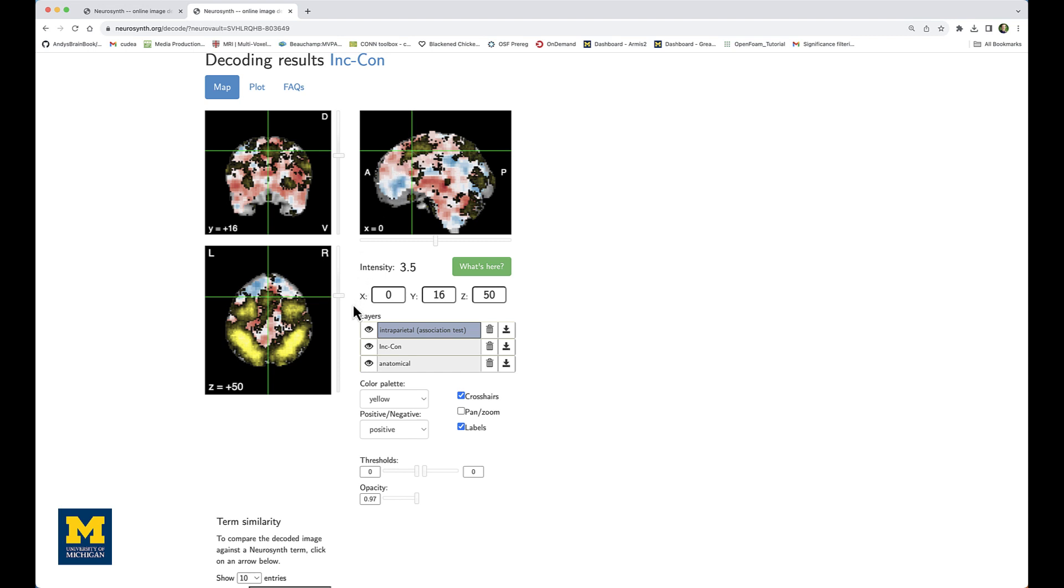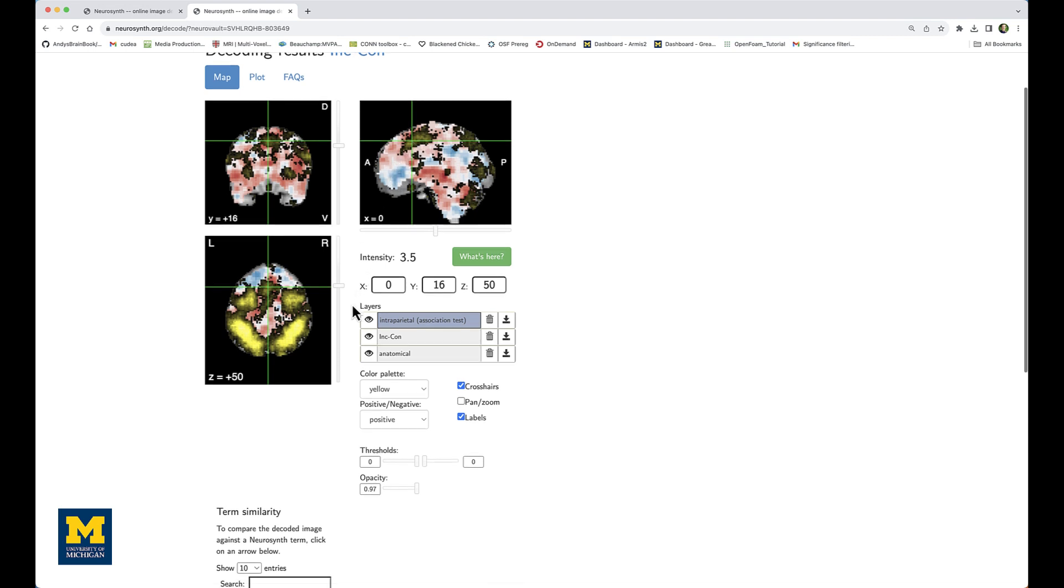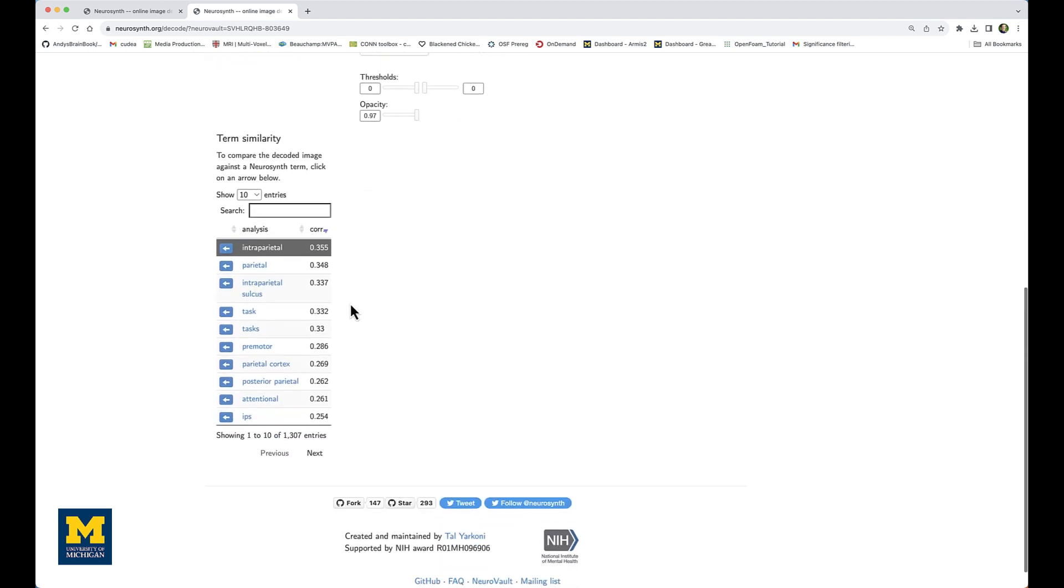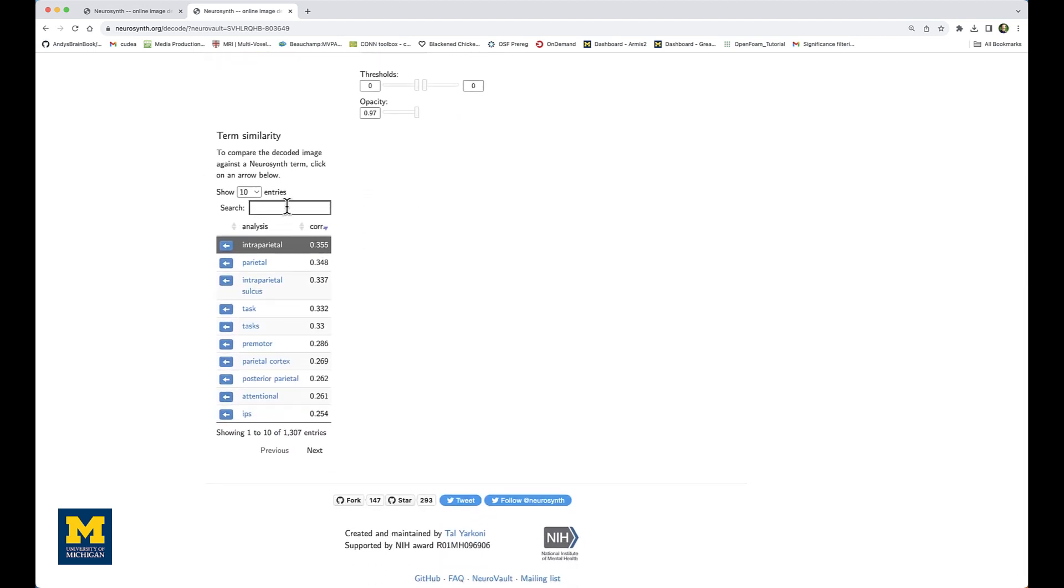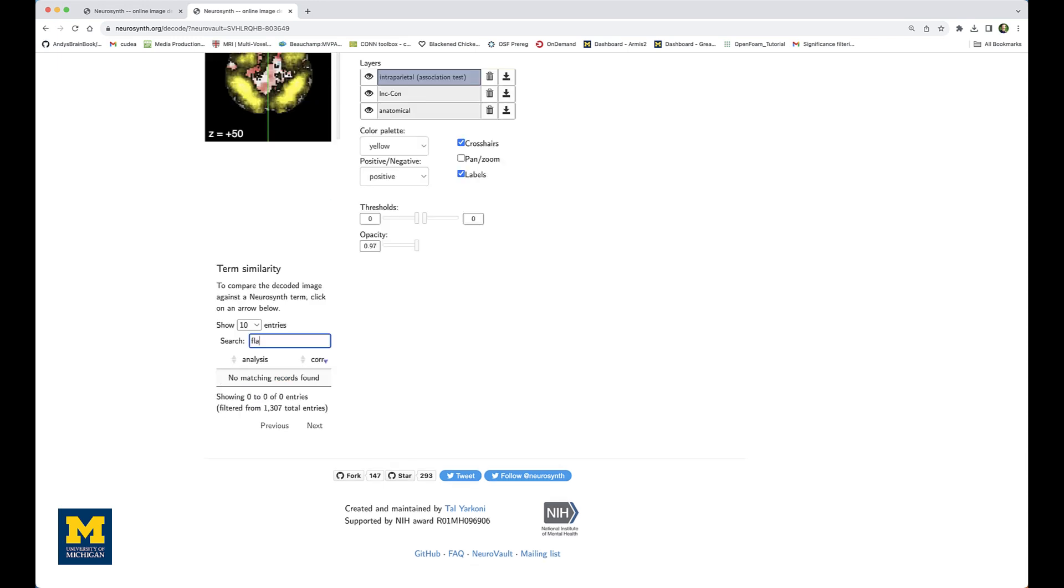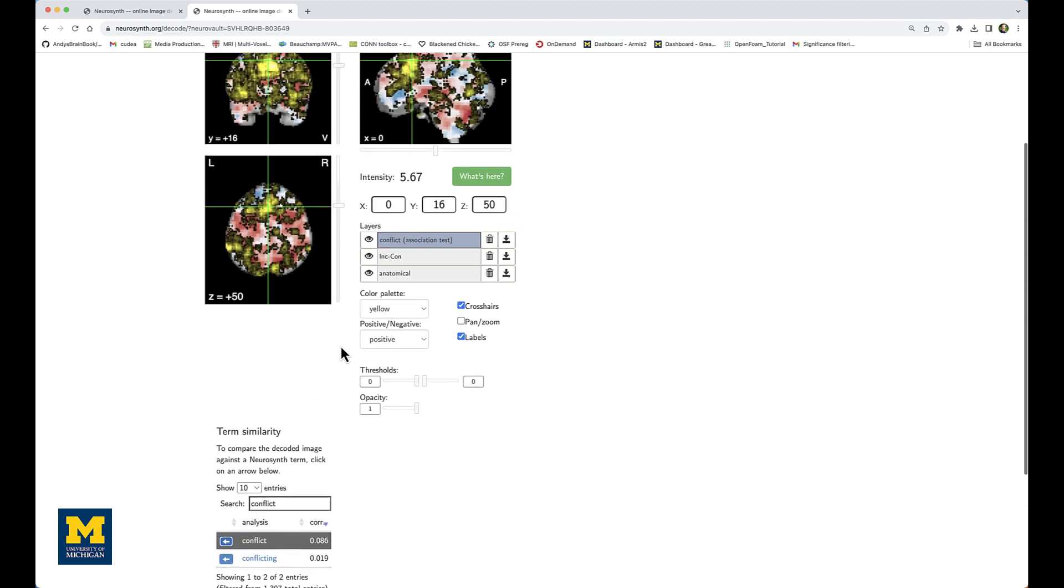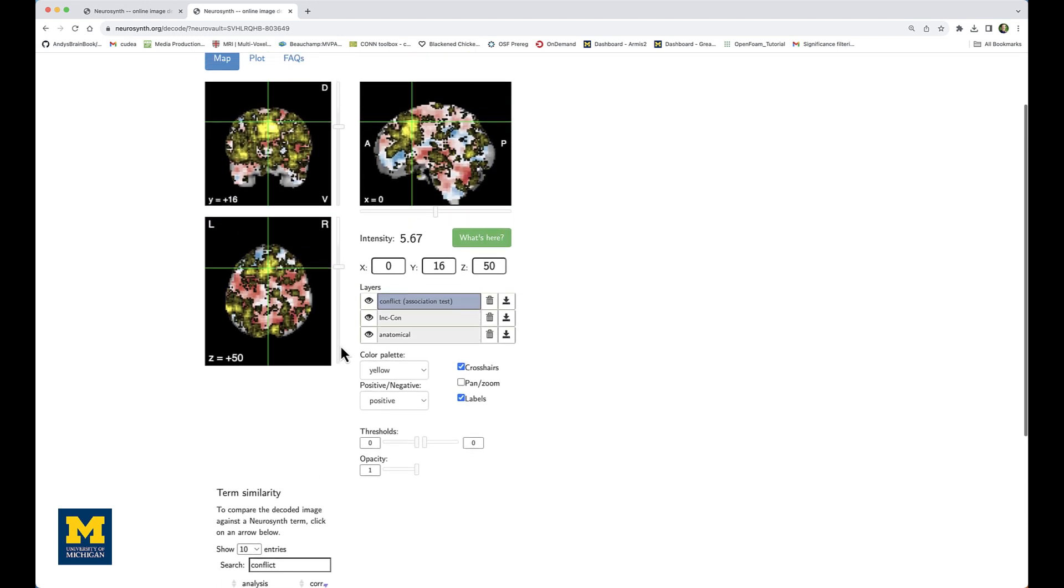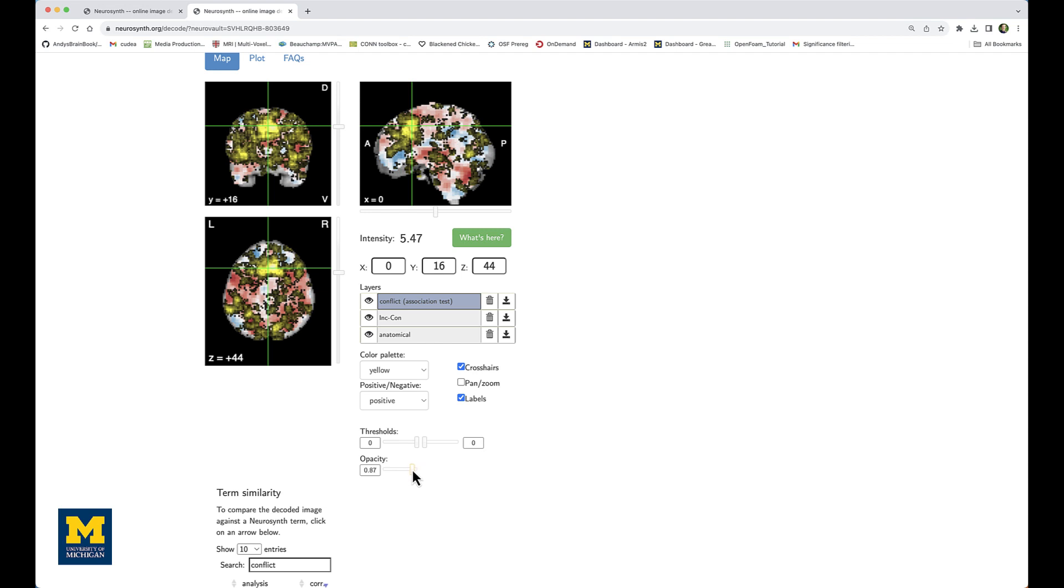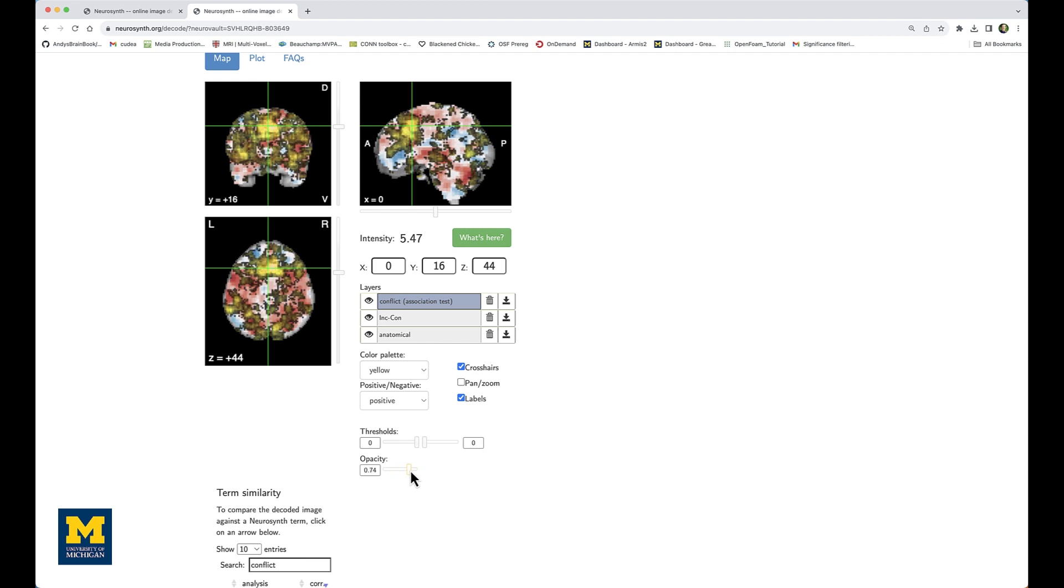If I scroll back down to the term similarity options, in the search box I could look for a term such as flanker, which actually is not in the meta-analysis database, or something related like conflict, which has a lower degree of correlation. But you can see that this region in the more medial prefrontal area has some higher correlation with that pre-SMA cluster in my group level analysis.